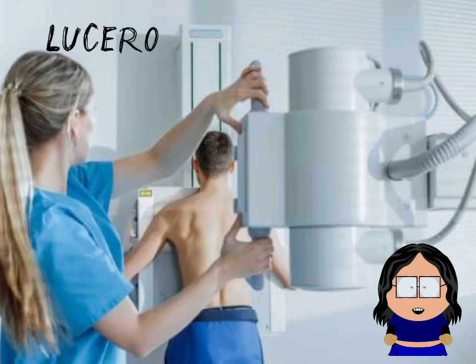Components of X-ray equipment. X-ray machines consist of several key components. X-ray tube, the heart of the equipment, where energized electrons collide with a metal target to produce X-rays. Collimator controls the size and strength of the X-ray beam, reducing unnecessary exposure. Detector or imaging receptor captures the X-rays passing through the body to create an image.